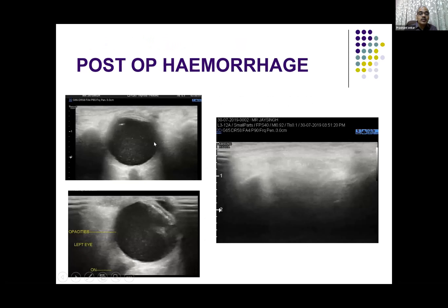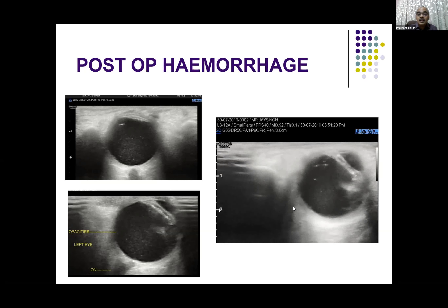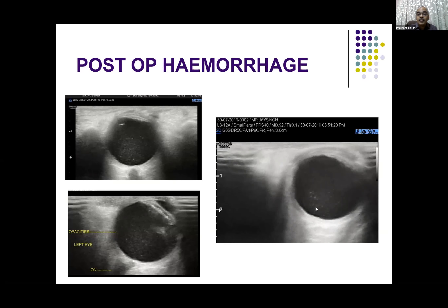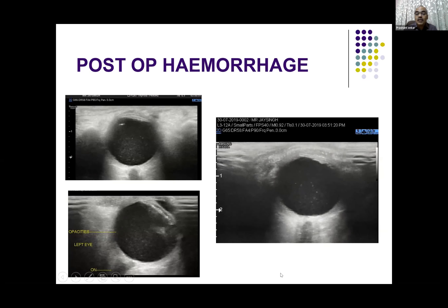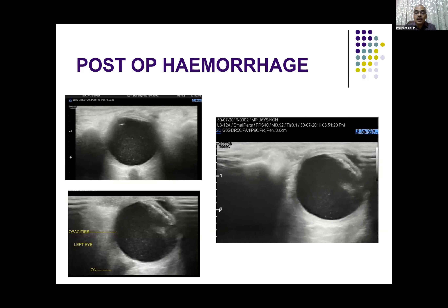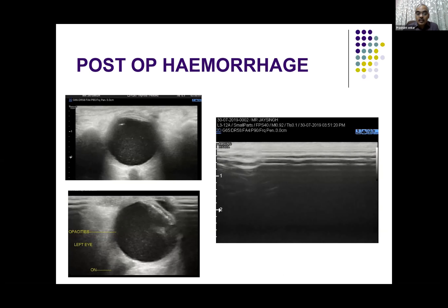This is a case where you can see numerous internal echoes — very fine — filling the vitreous completely. This was a post-cataract surgery case, and you can see those internal echoes. On eye movement they are very freely mobile and show after-movement, as described. This is how you try to differentiate from floaters.